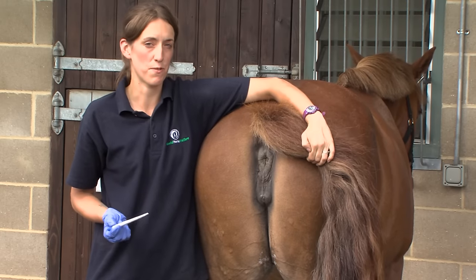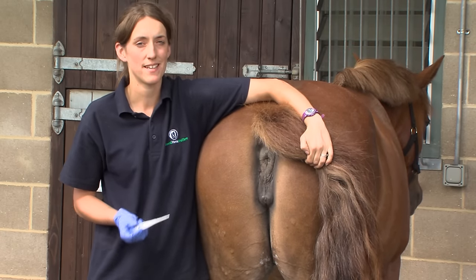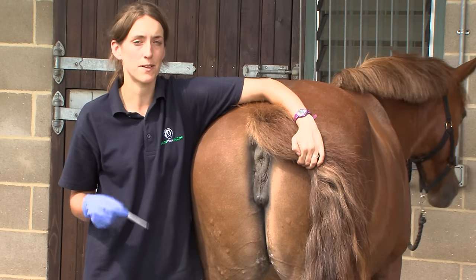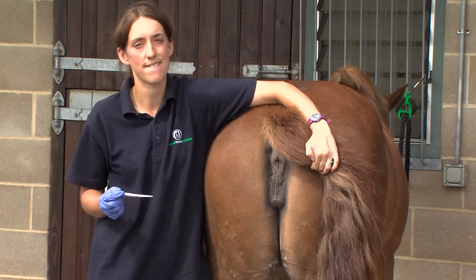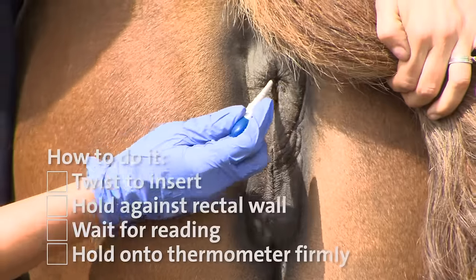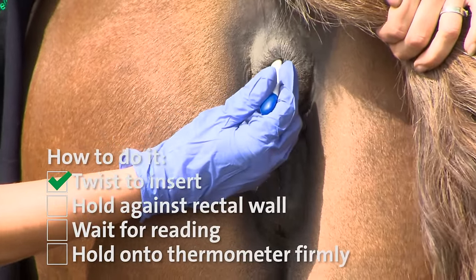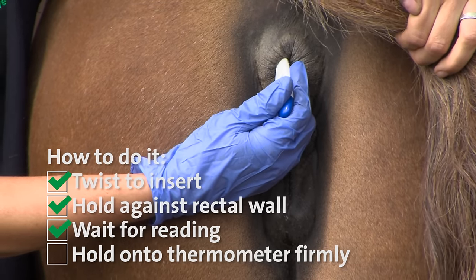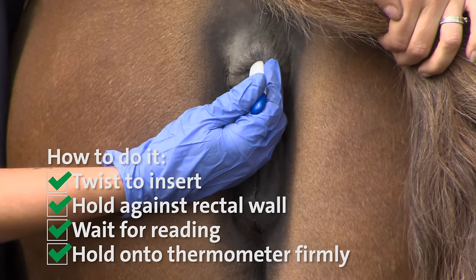If you're using a digital thermometer, at this point you just need to make sure it's turned on. If you're using a mercury thermometer, you just need to give it a couple of quick flicks to shake the mercury down to the bottom so that you can make sure you get the correct reading. I'm going to insert the thermometer into the anus using a twisting motion because it can be a little bit tight, and then tilt it so that it touches the side of the rectal wall. With the digital thermometer, I'm just going to wait until it beeps.